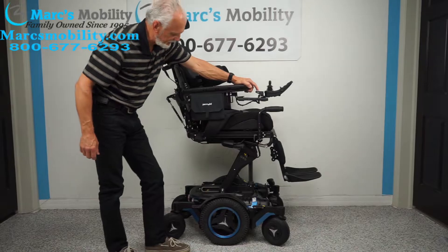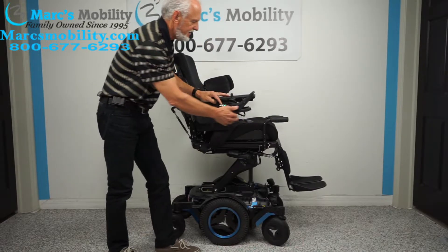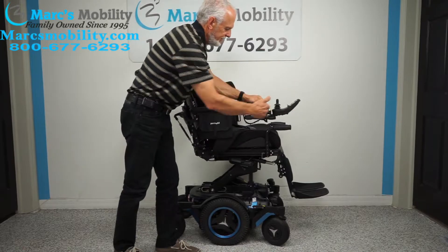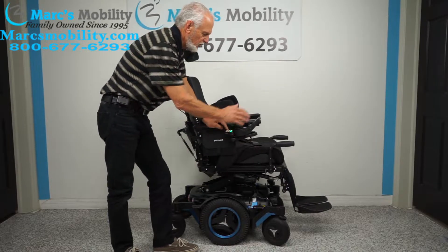I'm going to bring the seat lift back down. While the seat is going down, let me talk about the swing-away joystick. If you want to get close to a dining table, look how much closer you can get — I just took away about nine inches. It's called a swing-away, and if you're left-handed we can put the swing-away on the left side.